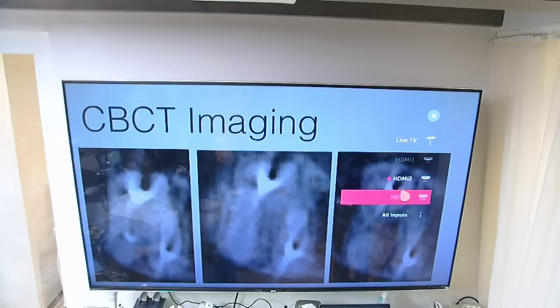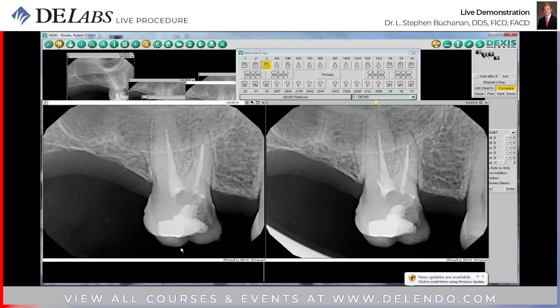And do you now take a CT scan before every treatment? Before every consult. Anytime in treatment that I'm having questions or concerns. And then, of course, we take a 40 by 40 limited volume post-operatively.